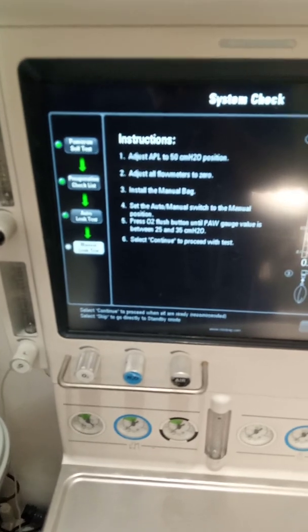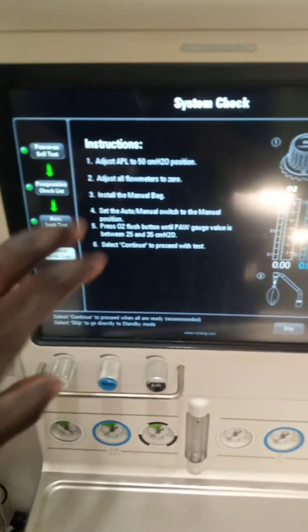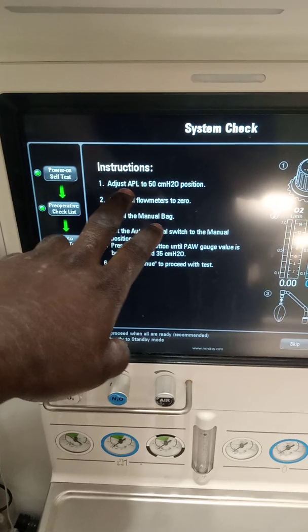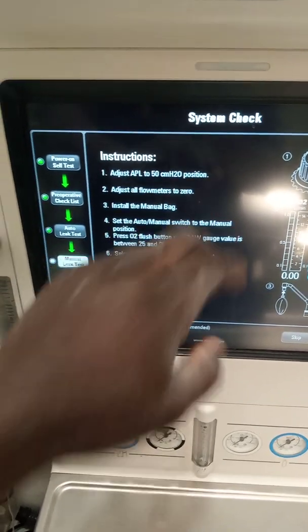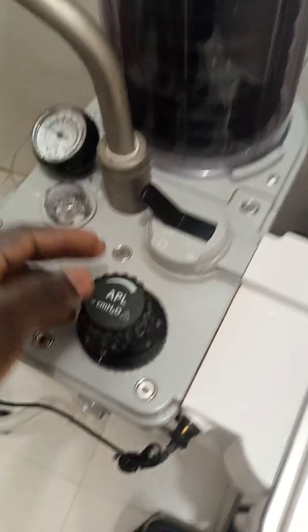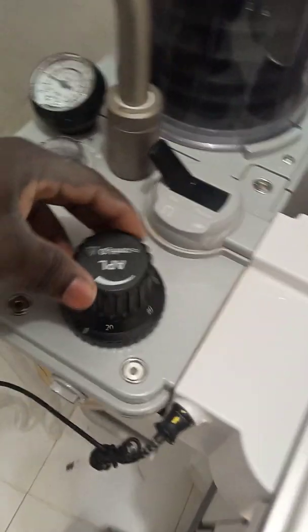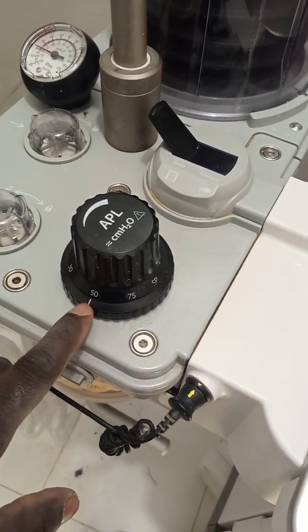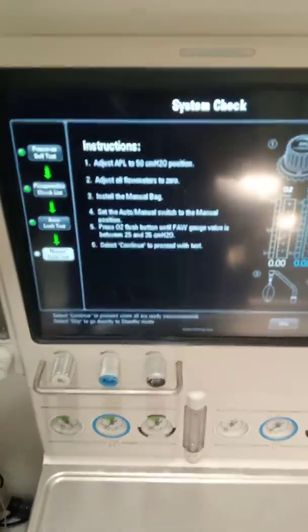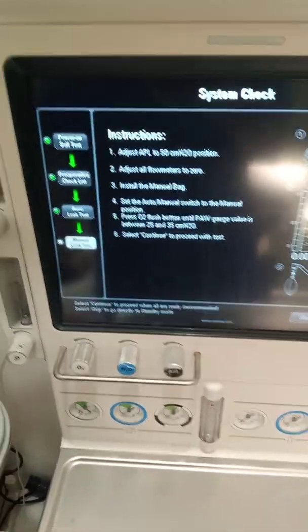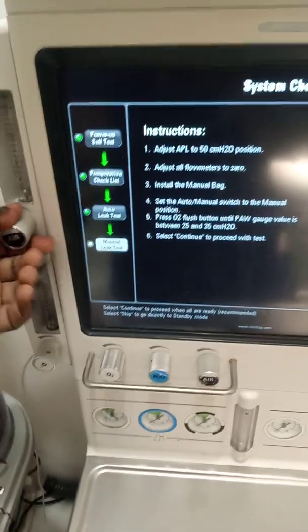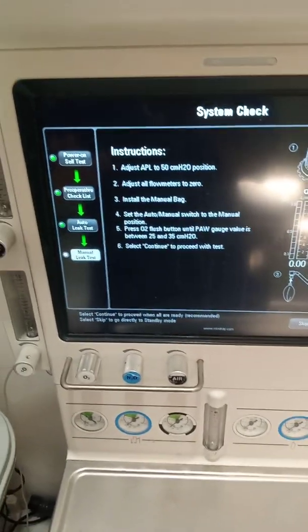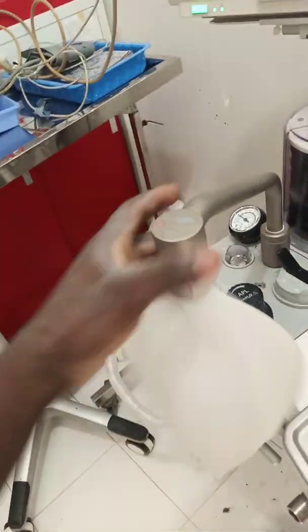We have different instructions here too. Adjust APL to 50 centimeters of water position — this is our APL and we are going to adjust it to 50 centimeters of water. It is adjusted to 50. Adjust all flow meters to zero — flow meters have all been adjusted to zero. Install the manual bag, otherwise known as the reservoir bag — it is firmly installed, as you can all see.